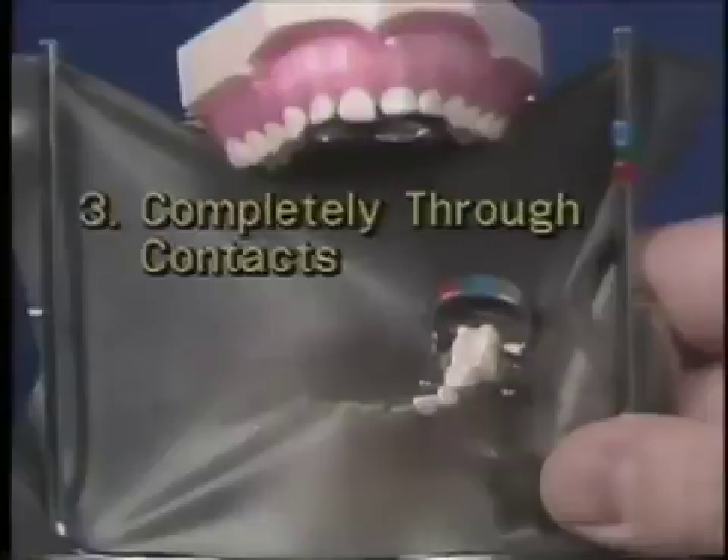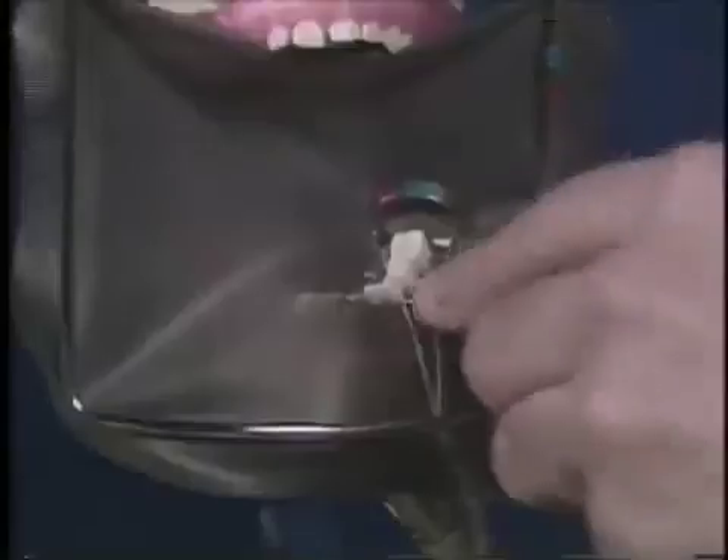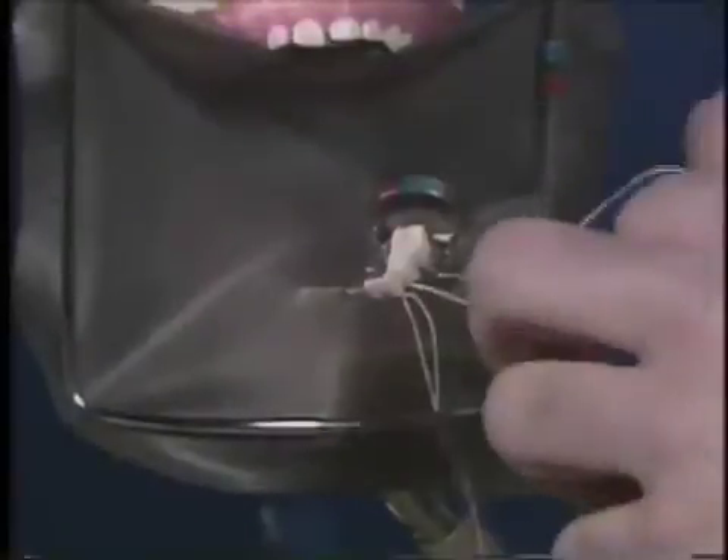The interproximal portions of the rubber dam should be completely through the contacts between the teeth. The last step in the rubber dam procedure is to tie dental floss ligatures around all of the teeth that are isolated except the clamped tooth. The dental floss should be long enough to have sufficient length to work with comfortably. Seat the floss through the contacts and then tie the floss using a surgical suture tie — tie the first loop through twice and then loop back in the opposite direction. It is your choice whether to cut off the extra length of dental floss or to leave the ligatures uncut. Leaving the ligatures long may offer one advantage in that the excess length will allow you to retract the rubber dam cervically if the need should arise.